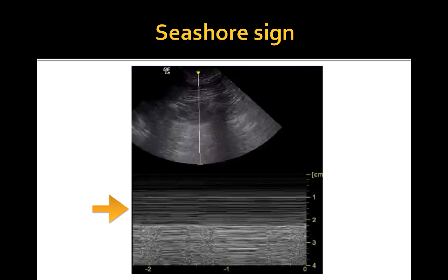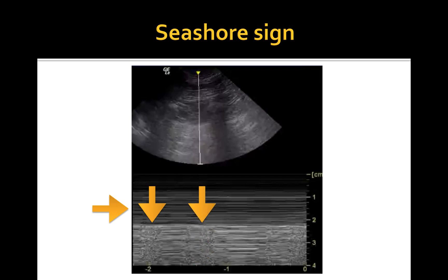presence of lung motion demonstrates an irregular, granular pattern as pointed out by these vertical arrows. The seashore sign or granular pattern are consistent with absence of pneumothorax.